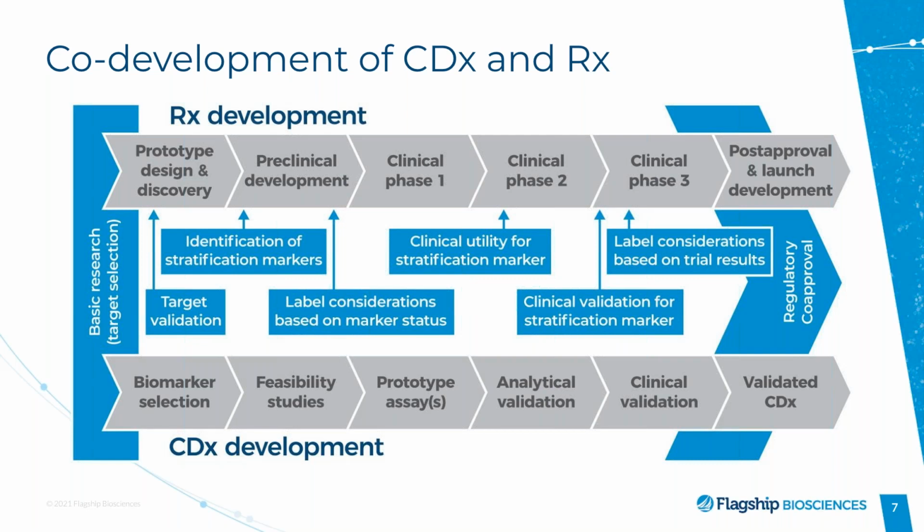At the same time, even though this trial is ongoing for us, we are still planning for success, and we are starting to think more about the next step as we move further along the CDX development. That next step is really taking our laboratory developed test and transitioning it into a registrational in vitro diagnostic. You can think of this as an assay that will be locked down. Hopefully it'll be the test and assay that you use after approval of your drug.